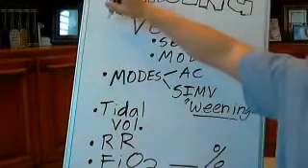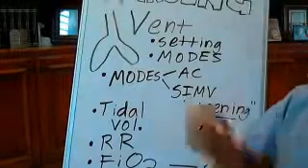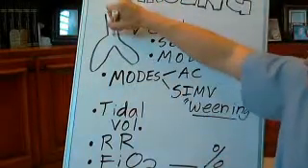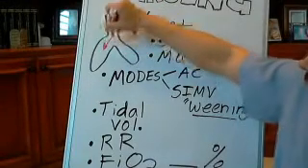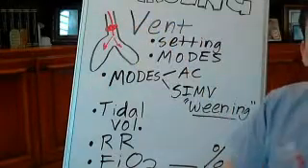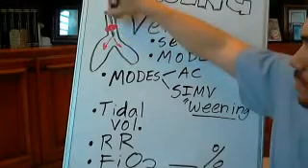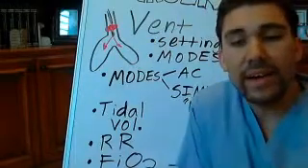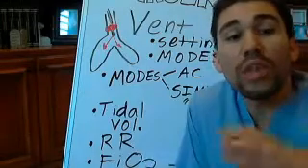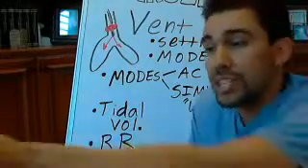So when your patient is on an ET tube or a vent, an endotracheal tube here, we're basically putting a tube down into the respiratory tract, inflating a balloon, and pushing air through this endotracheal tube, okay? Your patient can also have an opening right here, where we're putting a tube right there, as well as just breathing for your patient, okay?